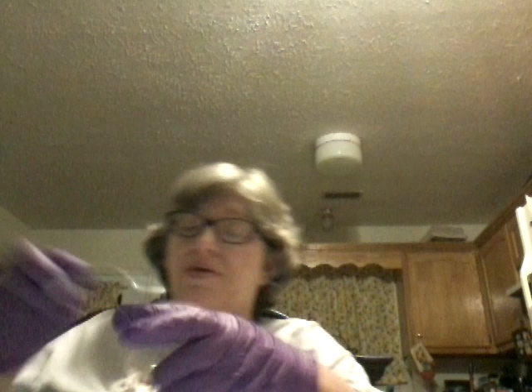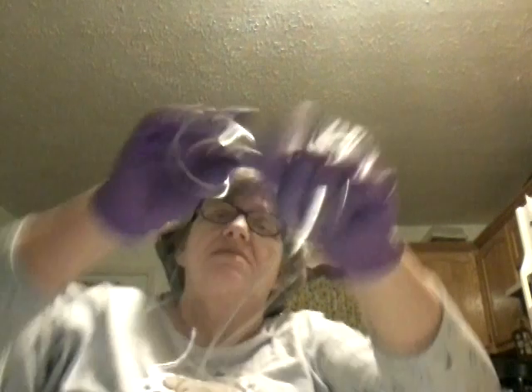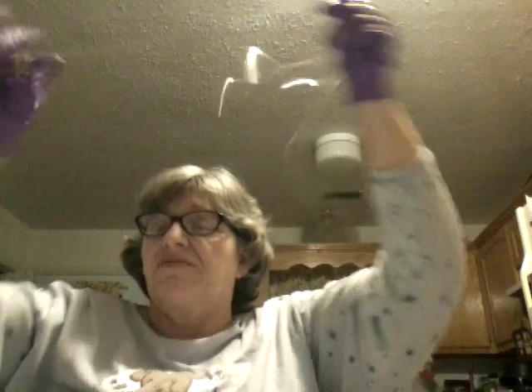While that's happening, I'm going to open up the pump here. I already changed the battery, so they're nice and brand spanking new. I don't know why they don't send me a pump that has its own plug so we don't have to use batteries 24/7. I'm going to lock this up and then put all of this stuff into the pump where it belongs. Yes indeed, this is a process that I was trained how to do.